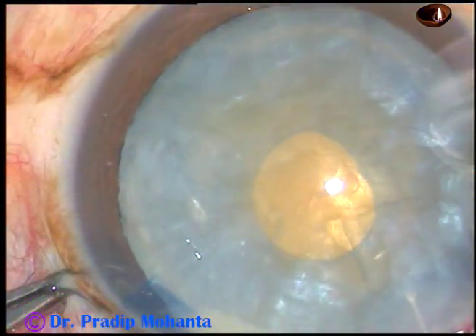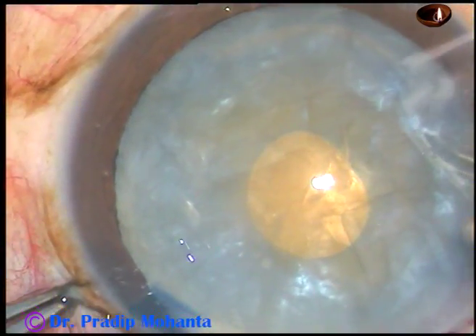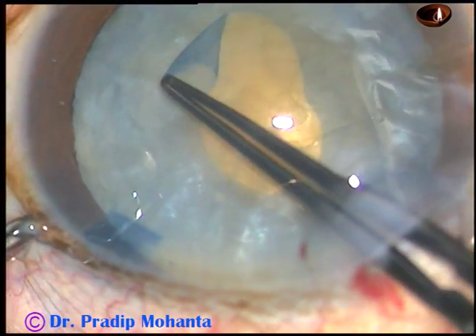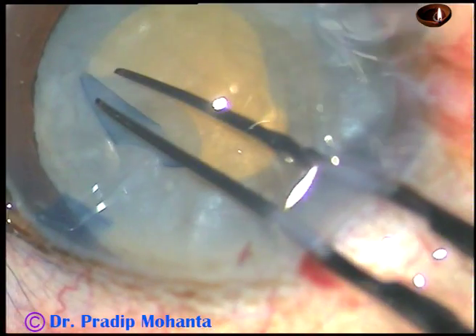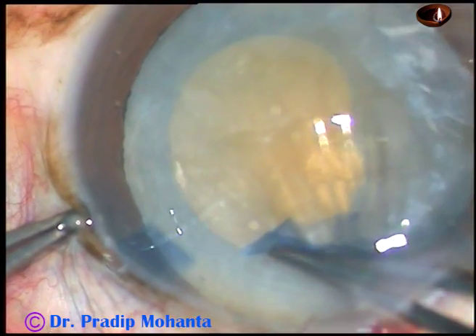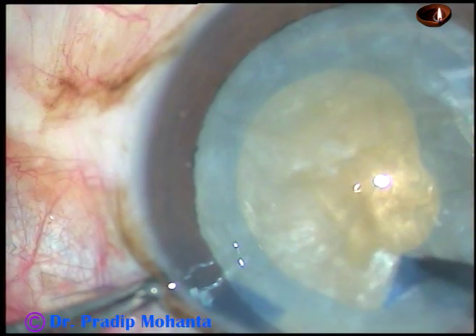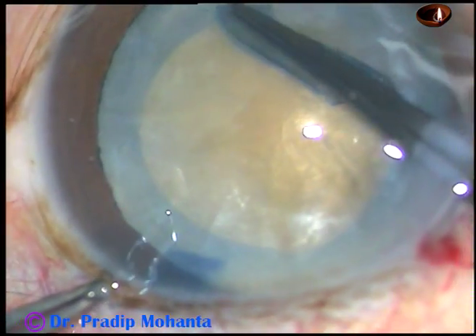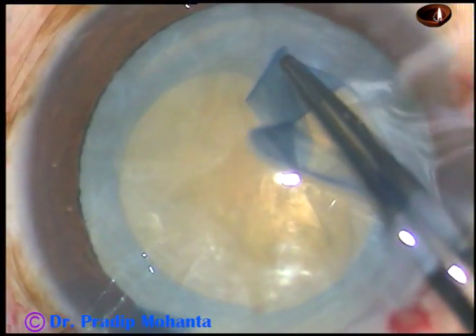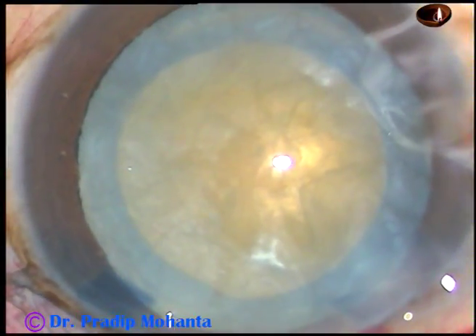Again, HPMC has been injected. Now I take a Vannas scissor and make a small cut — it should not be a radial cut, it should be an oblique cut at the capsulorexis margin. And now the rexis is being enlarged to an optimum size. In this way, we can do capsulorexis in intumescent cataracts very well.